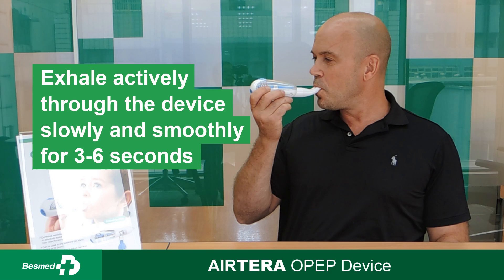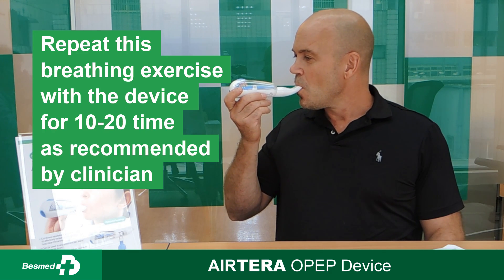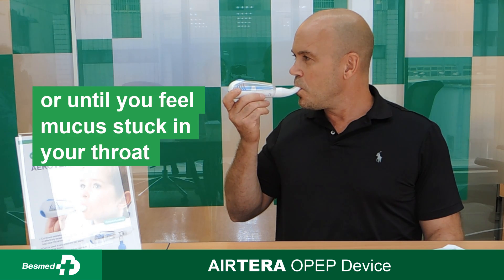Exhale through the tube and breathe through the device for 3 to 6 seconds. Repeat the breathing exercise with the device 10 to 20 times. Always use as recommended by a healthcare professional.